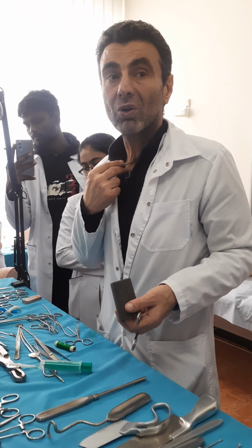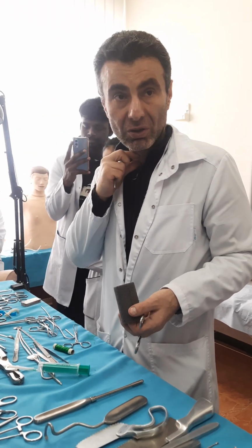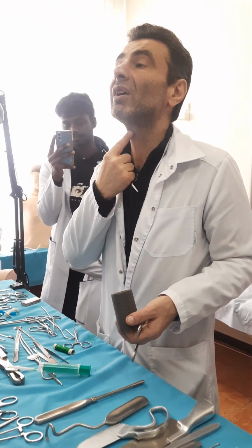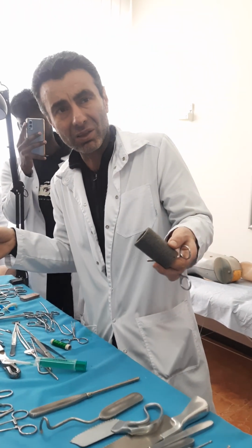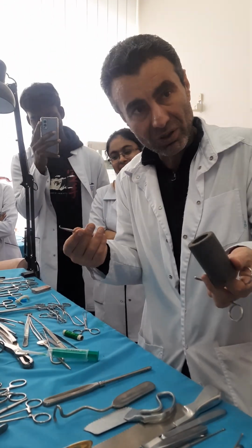Then you make the horizontal arcuate type of incision. Usually it's located inside natural skin folds and it's not visible. A vertical descending incision is much more visible afterwards. But anyhow, now I don't want to teach you how to make a tracheotomy. We'll study it after. I want to show you how we use these surgical instruments.